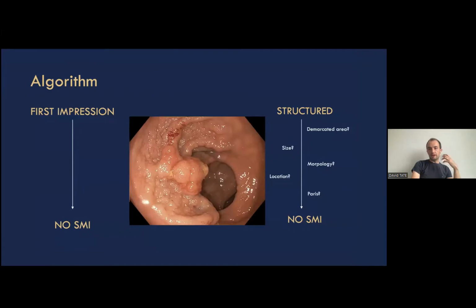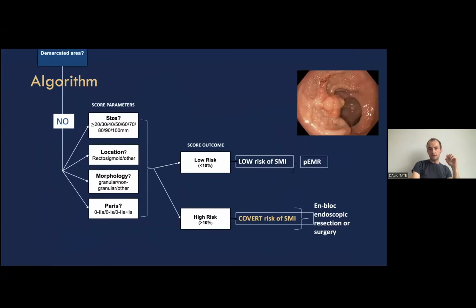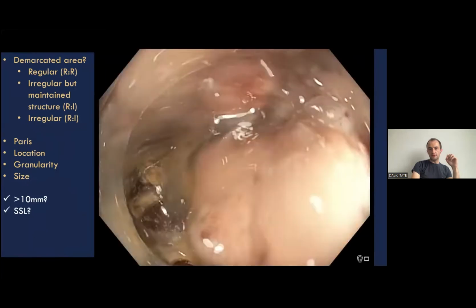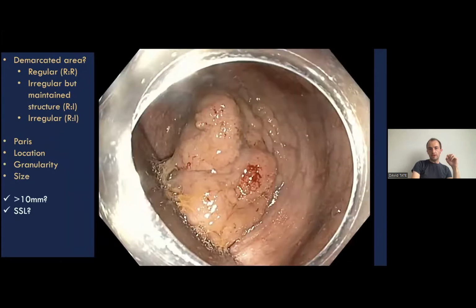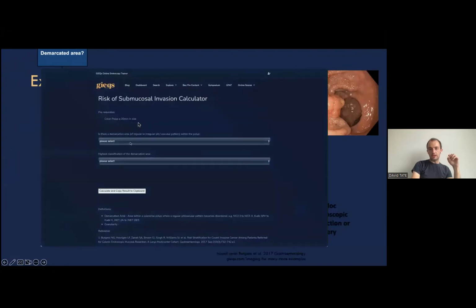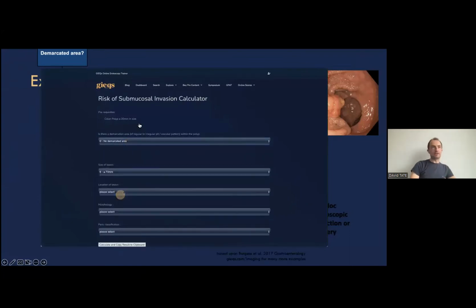This is a little bit our algorithm of how we might get into it, but first of all, we will just take you through the examples. Okay, so we will just come back to that, but to impress upon you that some of these things here can definitely change the risk of cancer within a polyp if you don't find a demarcated area. And while we're doing the examples that we're about to come to, because I really want to make this interactive, then you can follow along yourself.